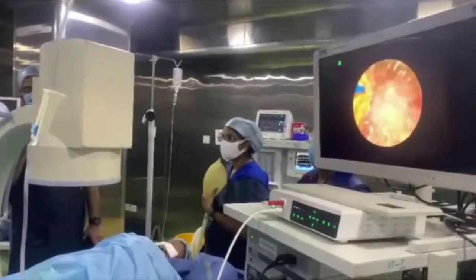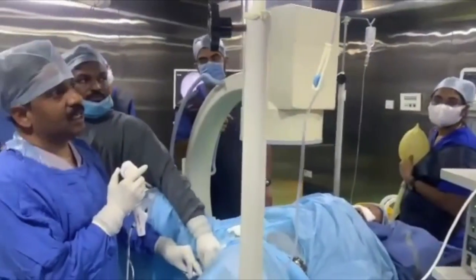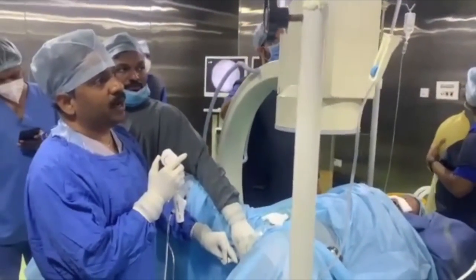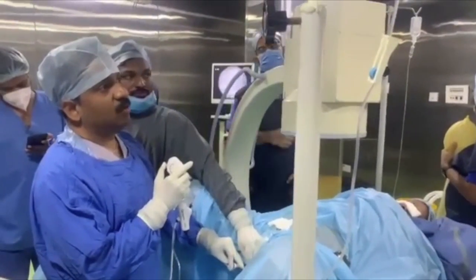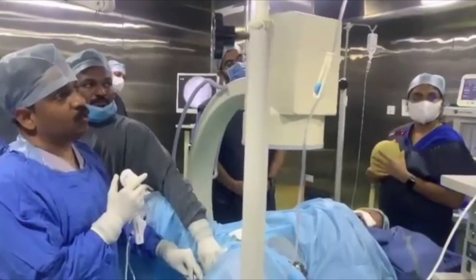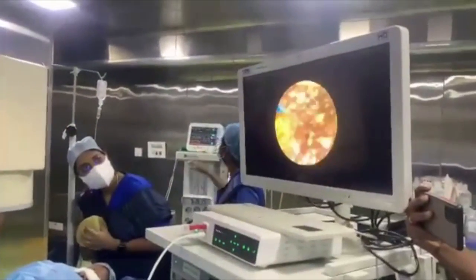As of now, we do not have many digital scopes which can pass through a 9.5 by 11.5 sheath. Some scopes are 7.5 at the tip, but they do not have a shaft diameter of 7.5. This scope has successfully gone through the 9 by 11.5 access sheath.